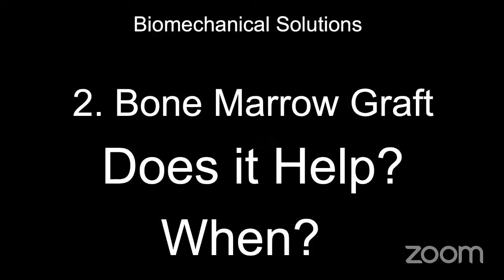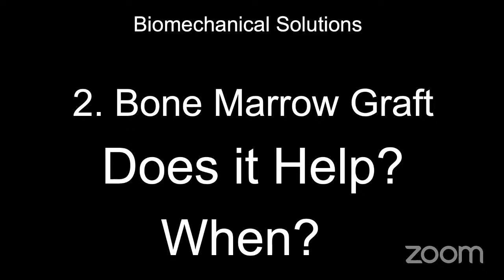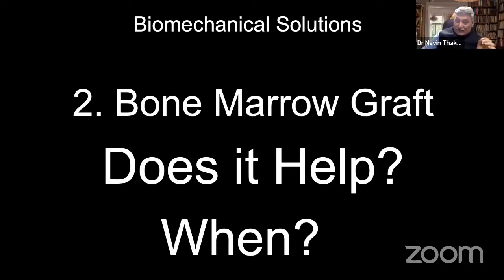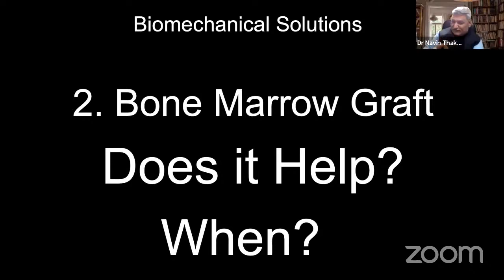Naveen bhai, my one observation here: all nails are there with trochanteric entry point with medialization in the distal femur. Is there any different nail available, because they all have trochanteric entry point? They are all cephalomedullary nails. But yes, you are right. If the nail entry and alignment is a little bit like that, then there won't be a collapse of the fracture in the shaft. Yes. That is preventing it, not in the alignment, the medullary canal. So that is slightly preventing.